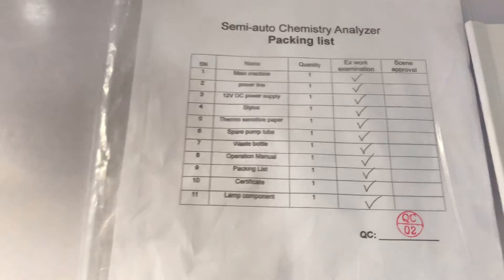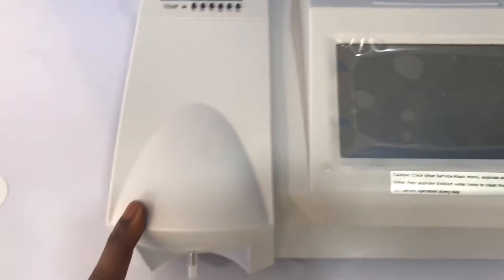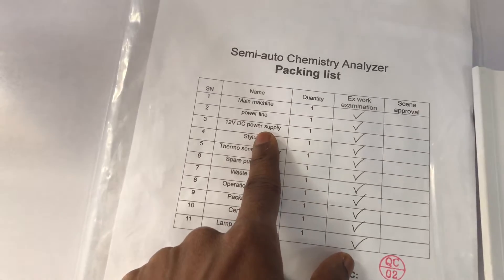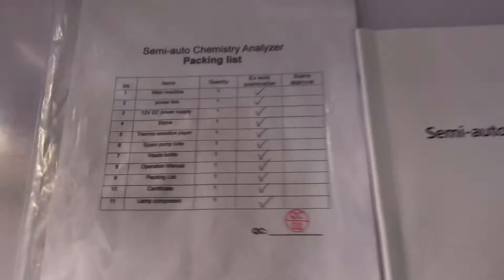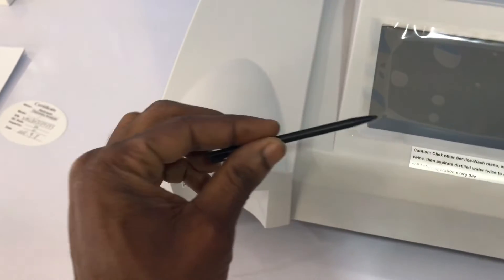In the packing list we have the machine itself, which is the semi-auto chemistry analyzer. Then we have the power line and the 12-volt DC power supply — that's this one here — and then the adapter, which I have connected like that.